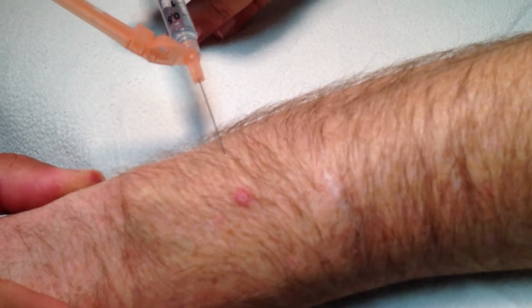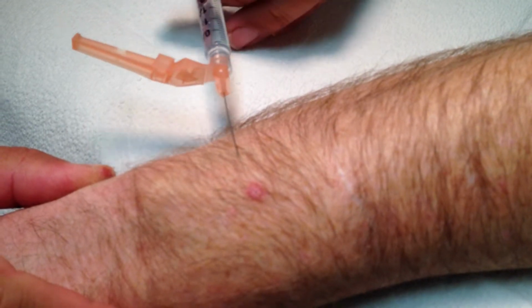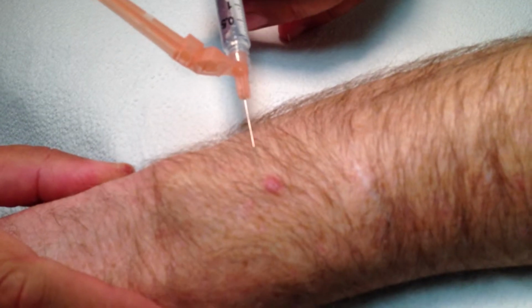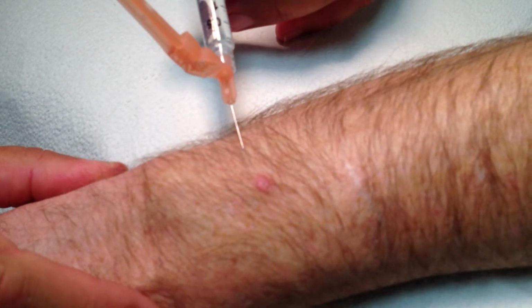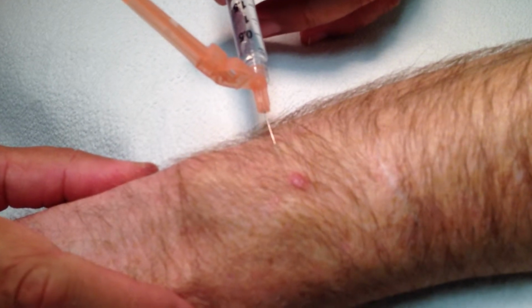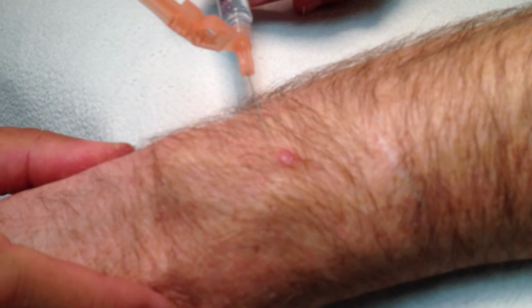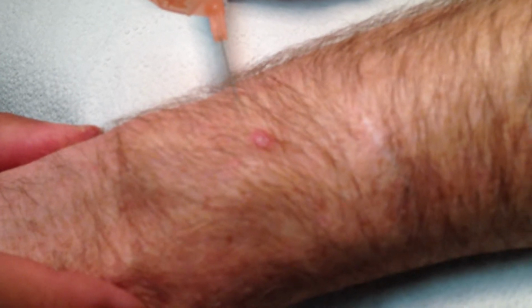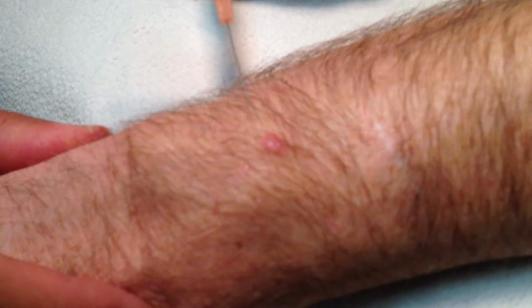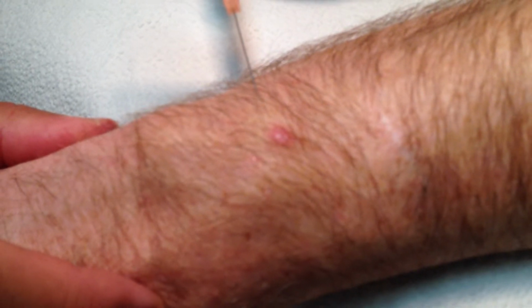I'm going to come out to the side and inject under the skin and follow along one side as I inject, and the needle is advancing. And you can kind of see the skin raise up and blanch perhaps, and it's getting thicker as the anesthetic is being injected. The patient is making a little bit of a face because epinephrine stings.